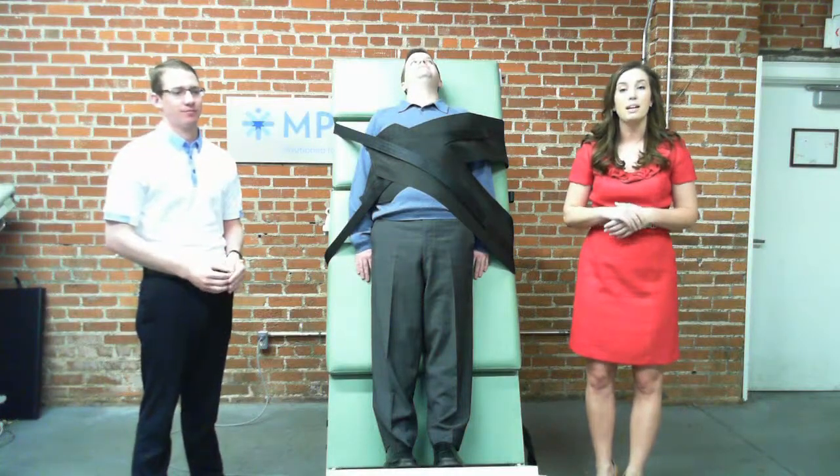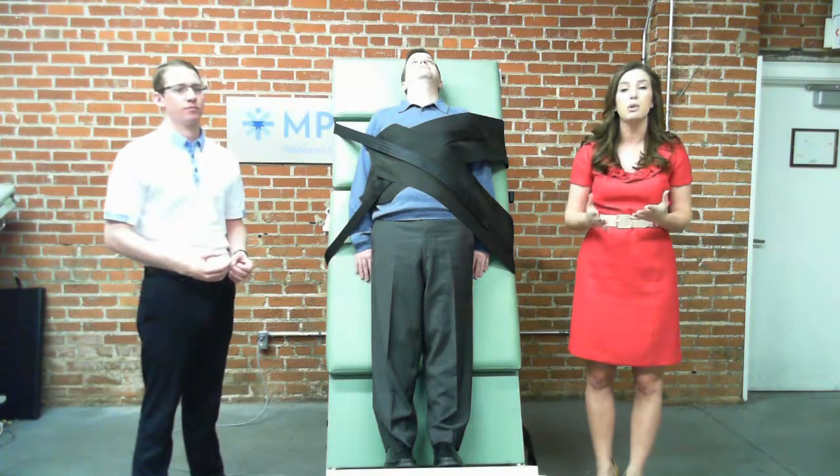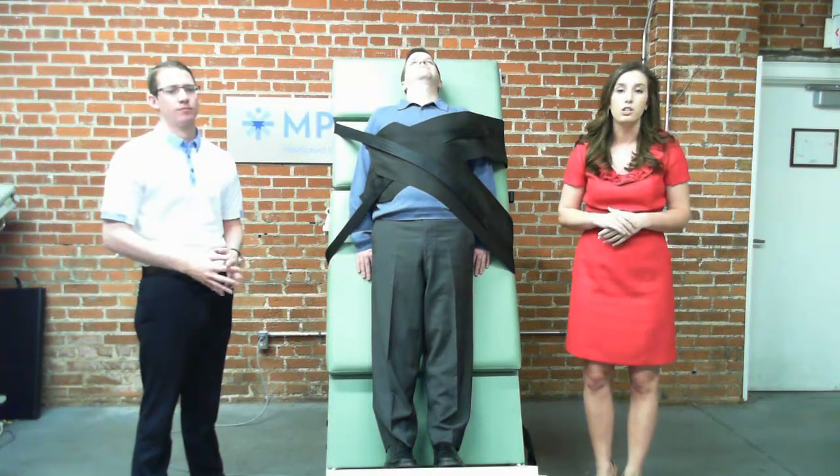Hi Shannon, Jennifer here with Medical Positioning. I know we spoke yesterday on the phone regarding your tilt table and your new pediatric cardiologist coming on board.